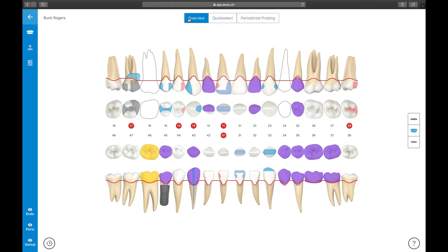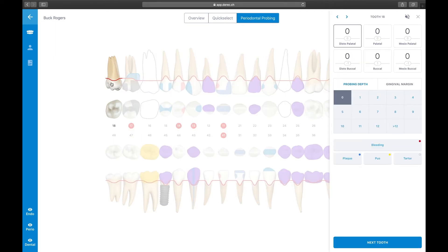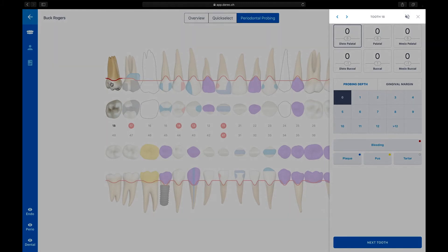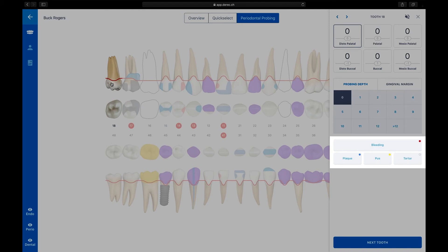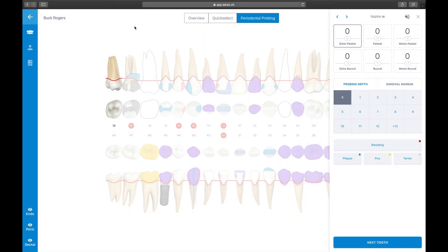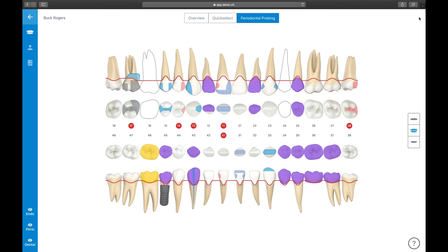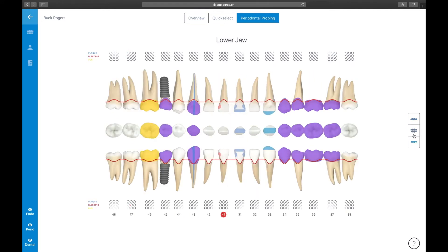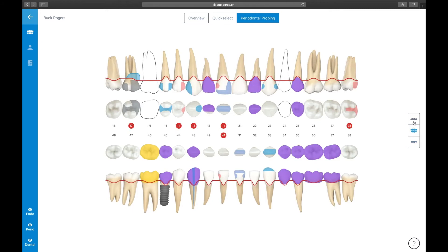Periodontal recording can either be performed in the single tooth view or, highly suggested, using the periodontal probing function in the chart view. By selecting the Periodontal Probing bar item in the top portion of the screen, followed by selecting the tooth you want to start your recording process, Derek will present the period pad for easy and fast data entering. The period pad consists of five sections: the status bar with buttons for navigating to the next or previous tooth, the six recording sites, a number field for entering probing depth, buttons for additional findings like bleeding, plaque, pus, or tartar, and a button for navigating to the next tooth from left to right. Since we record periodontal probings on the buccal and oral aspects of the teeth, we highly suggest switching to the upper or lower jaw view.